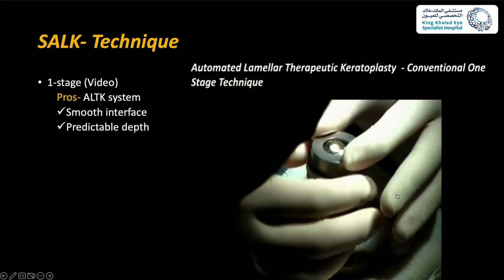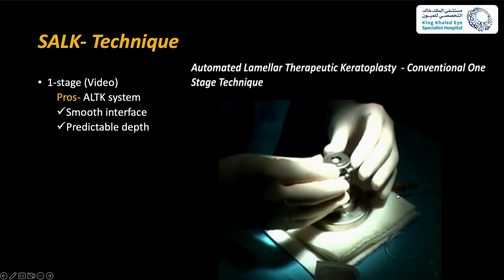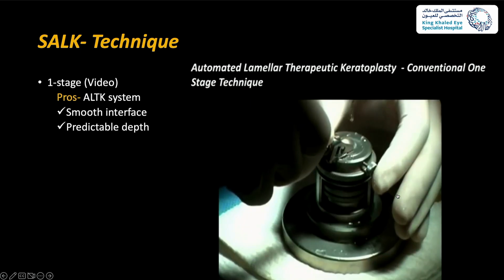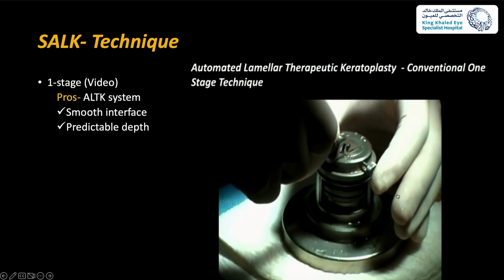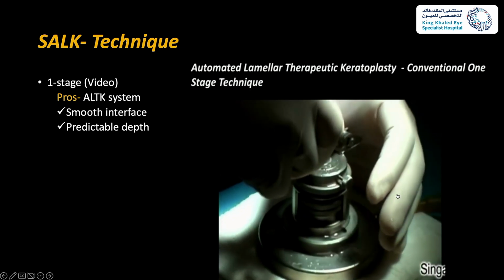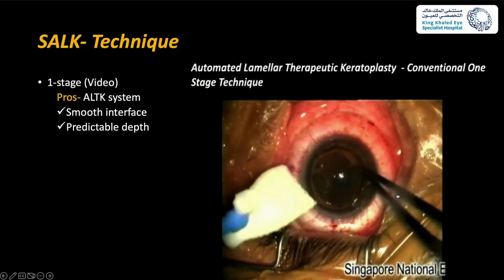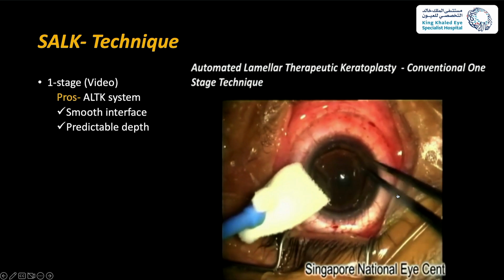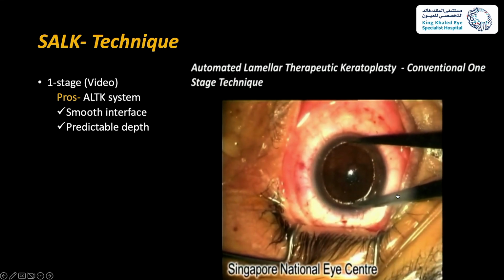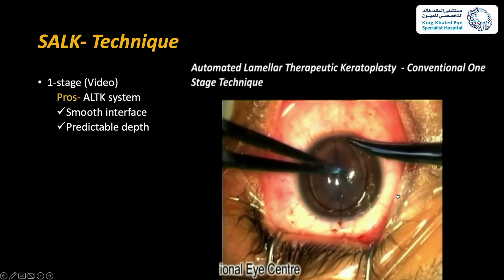And then we should use the artificial anterior chamber to mount the donor on top of it to produce an anterior cap from a donor cornea. So basically, you put the graft on and stitch it, and sometimes you can use bridging stitches, or you can use just a bandage contact lens to put the graft on.